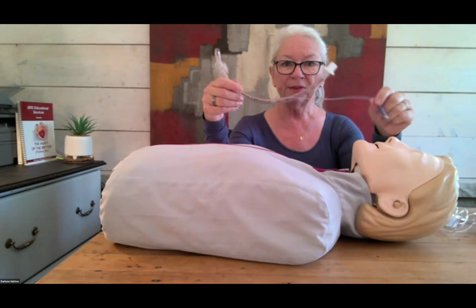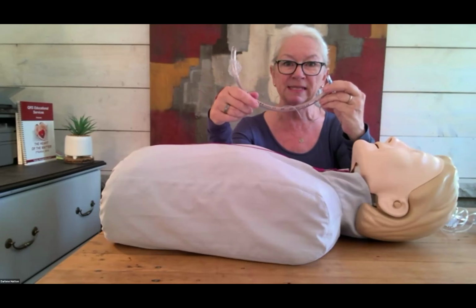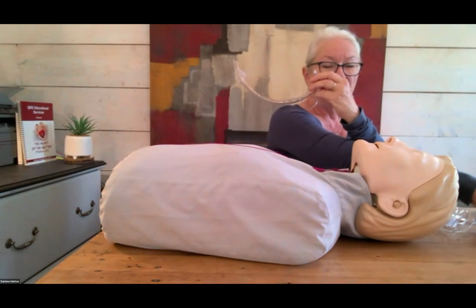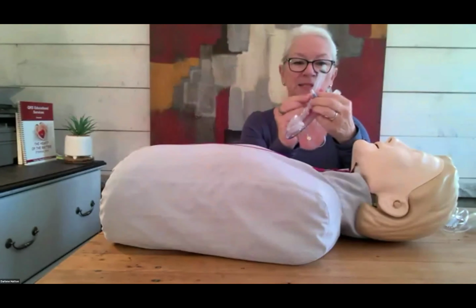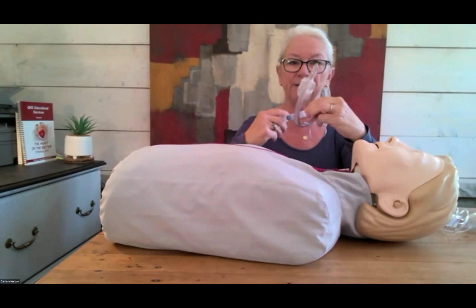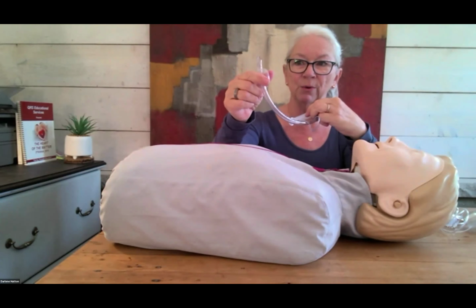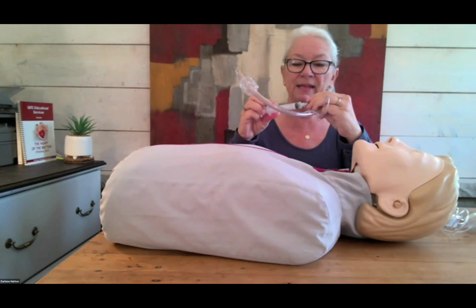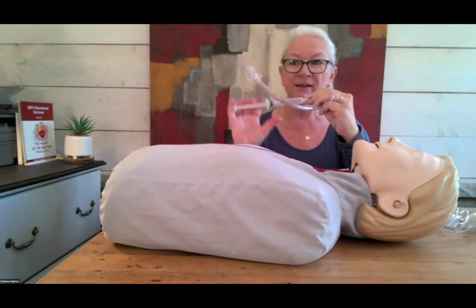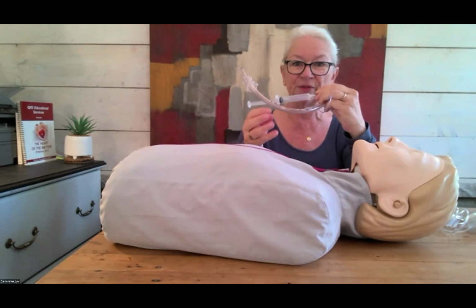When you take it out of the wrapper, it's always prudent to take a look and make sure that there is no cuff leak before this gets inserted into the patient. To do that, take your small syringe and put all of that air in and just ensure that there is no air leak. And then you want to make sure that all of the air is taken out. This needs to be completely deflated before inserting.